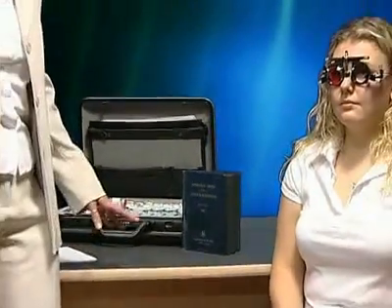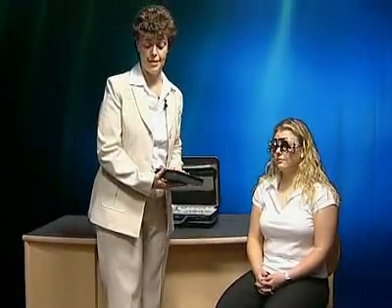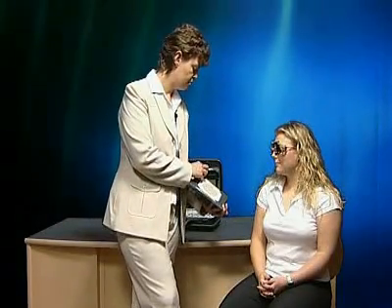It is then usual to repeat the whole process with the dominant eye. In 50% of cases, they will either want a complementary colour, something again in the warms, or a contrasting filter such as yellow or green. We've now chosen the specific filters Zara needs — in this case just the one lens, which in 50% of cases it is. You then take her back through the Ishihara test plates to check for improvement. It's a good idea to insert a contact lens so they can go out and look at their environment and somewhere colourful. When they come back, they can tell you how things look different. You can then give them the opportunity to choose either contact lenses or glasses.